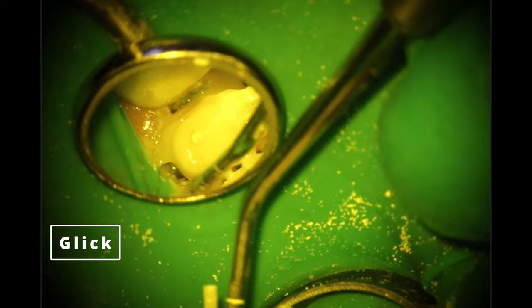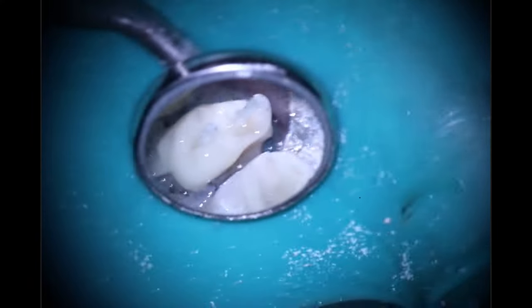Going in now to fix that final post — but first, smoothing out the outside using the Glick to almost create my interproximal surfaces. I noticed the palatal is off, pushed it a little with my hands, already looking much better. Going back to confirm it's fully seated — it dropped down almost a millimeter. Happy we caught that before it got bad. Going ahead and doing the light cure. You can see the little space the Glick created — that's going to create a nice space for the burrs to go in and do the prep work.